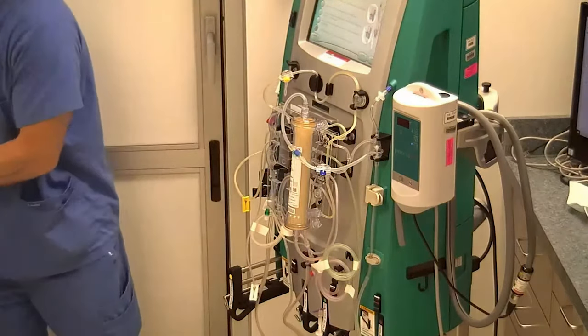And then one of our last steps here, it says connect return line to collection effluent bag. And you can see we have a blue line in the picture on the machine. So we're going to find our blue tubing. This is typically our return line that returns blood back to the patient. But for the priming process, it's connected to the drain bag to push all that priming fluid into our waste bag. So we're just going to connect the blue return line to the waste.